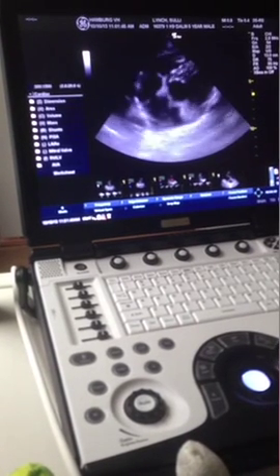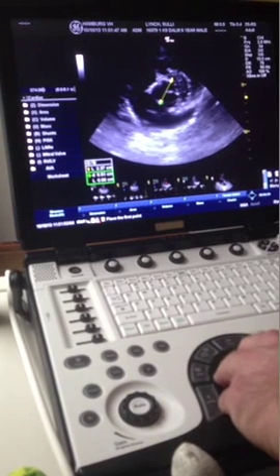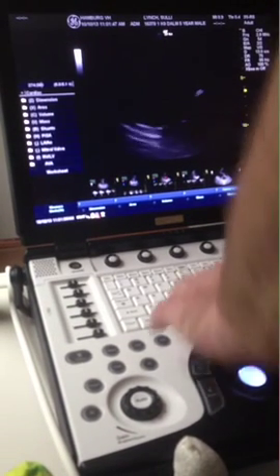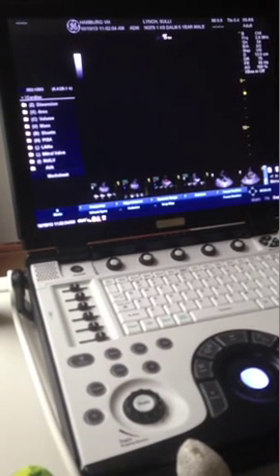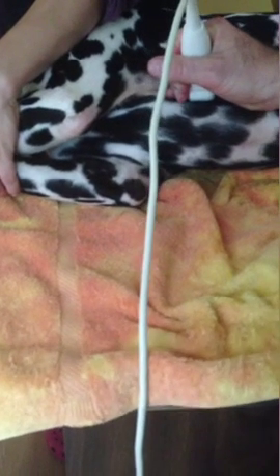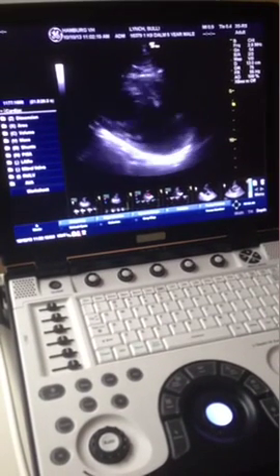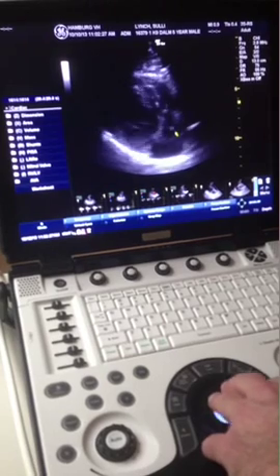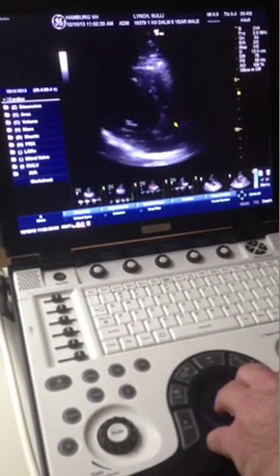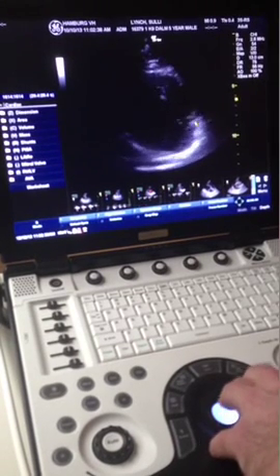I'll go to short axis and get a heart-base view of the aortic valve and the left atrium. Now I'm going to go to position 3 — patient still on right lateral recumbency. I push my hand down like holding a beer can and drop the probe right on it to find my window into the right atrium, coming right off of the sternum. I open up the window by pushing down on the lung. The right atrium, tricuspid valve, and right auricle come into view. If there were a mass here I'd see it right in that position. Save that clip.